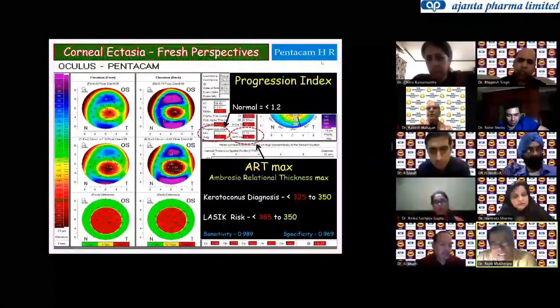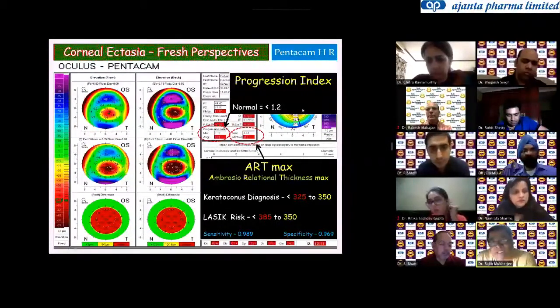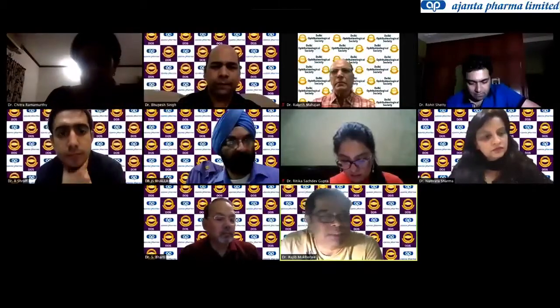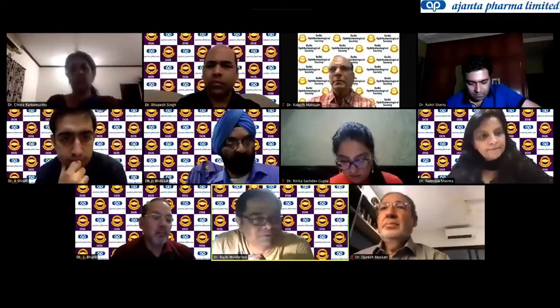If it's less than 1.2 progression index, I would say it's normal. And if your ARTmax is more than 385, I think we are in a safe zone. So these are the 2 things. I mean, if you really want to quantify in terms of the figurative value of 13 microns and 18 microns, then that may be it. But then I would analyze it differently.